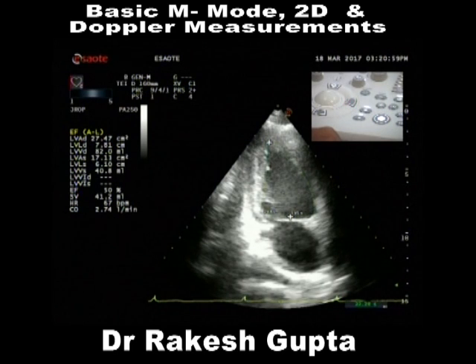Right? Now, apart from these measurements, what all we need to look at is the Doppler flow velocities. Sir, shall I show those Doppler flow velocities? You see all the valves and all? You saw peak and mean gradients, everything?